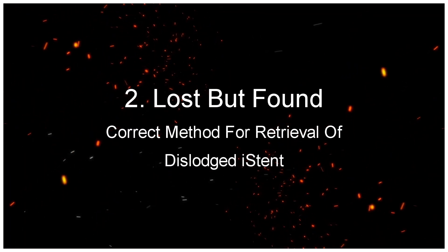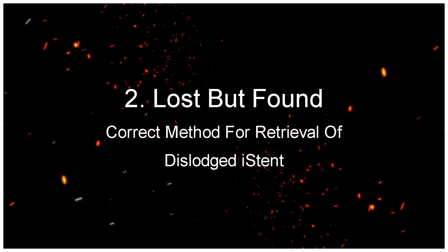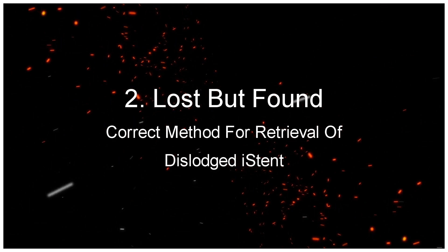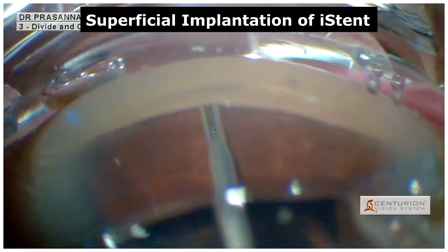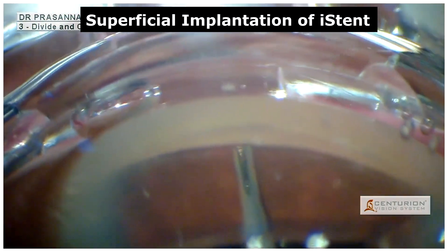Lost but found: the correct method for retrieval of a dislodged iStent. In this case, due to improper dimpling technique, the iStent was implanted superficially.